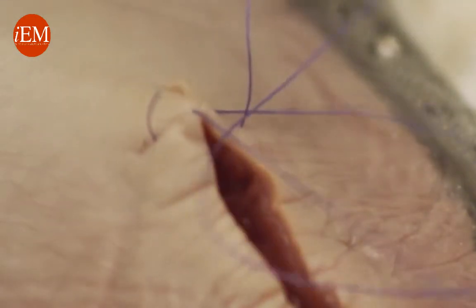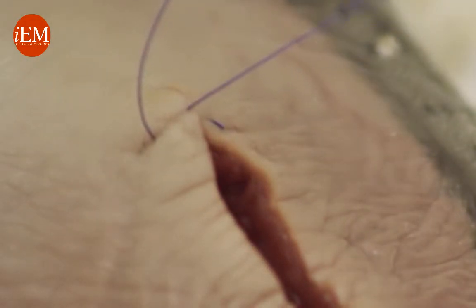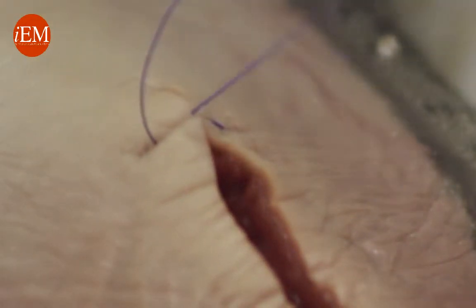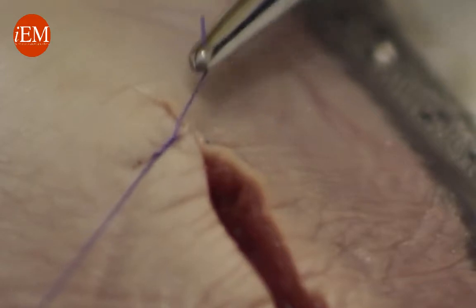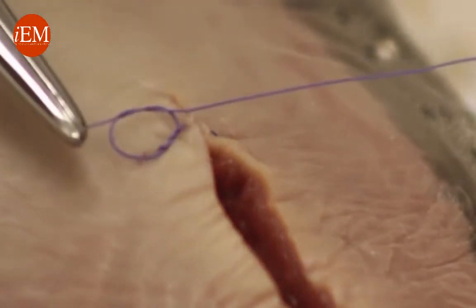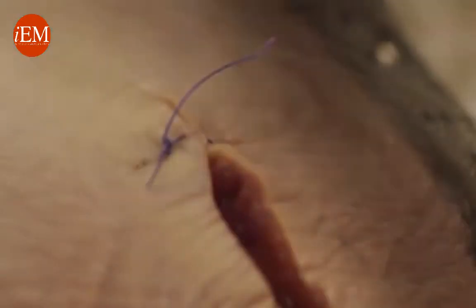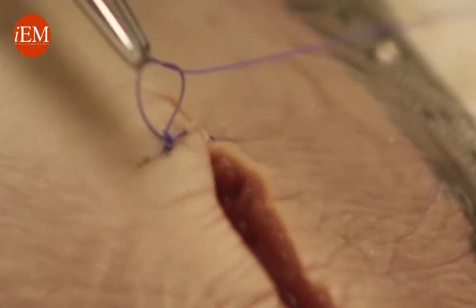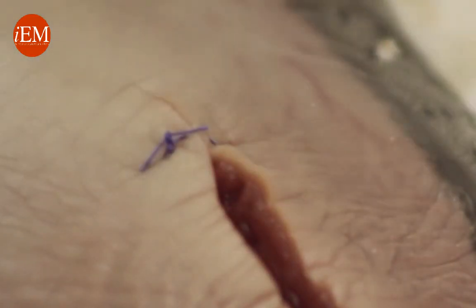I take my needle between my thumb and index finger, put it in my palm, wrap it twice, grab and pull. The second time, come down flat, put it in the middle, wrap it once, come down flat, wrap it once again, and come down flat. Cut, cut — and that's your vertical mattress.